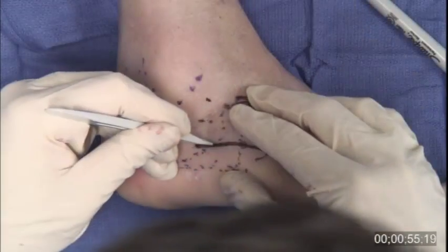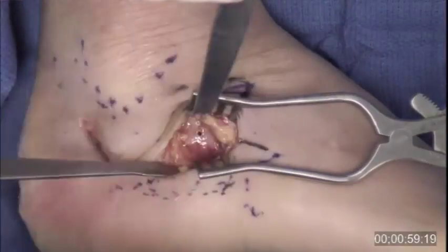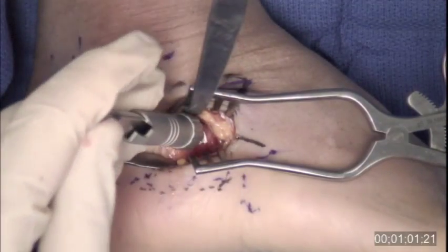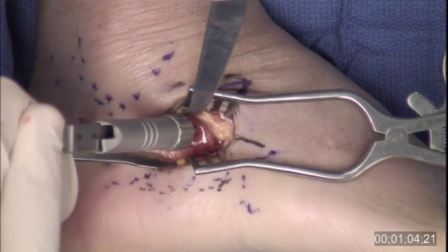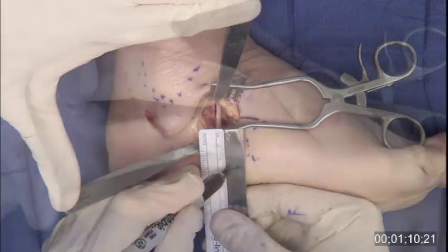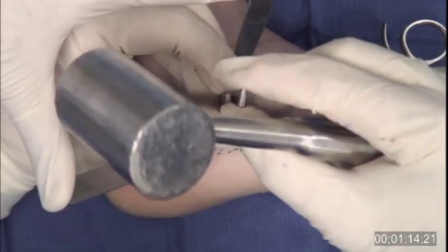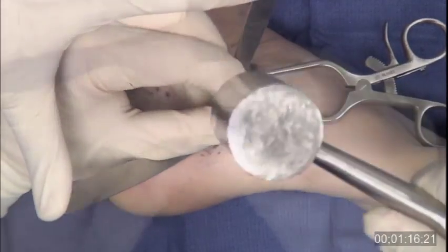The incision for the Evans osteotomy is centered over the calcaneal cuboid joint. The extensor brevis is retracted dorsally and the peroneal tendons are retracted. I typically drill a pilot hole at the osteotomy site, 15 millimeters proximal to the calcaneal cuboid joint, to ascertain the width of the bone. The osteotomy is performed with a saw and stacked osteotomes, with care taken to avoid violation of the medial cortex.